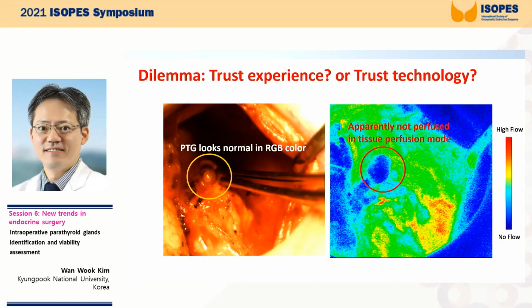This slide is the highlight of this presentation. I was in a dilemma of trusting my experience or trusting technology. Since this parathyroid gland didn't have any color change or edema and looked normal, I initially judged it as a normal healthy parathyroid gland.